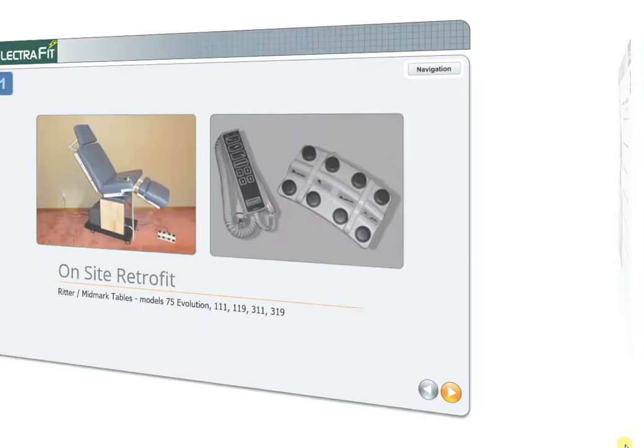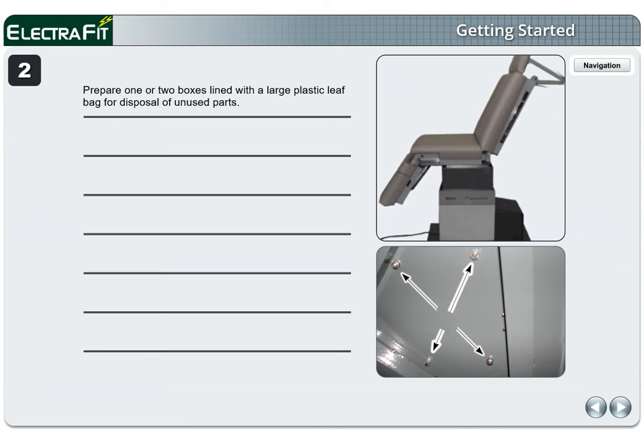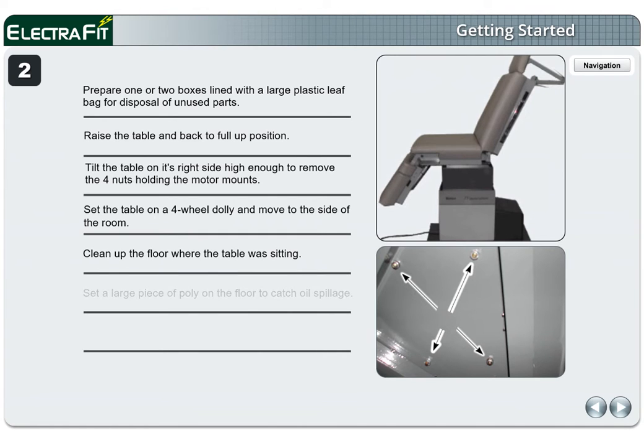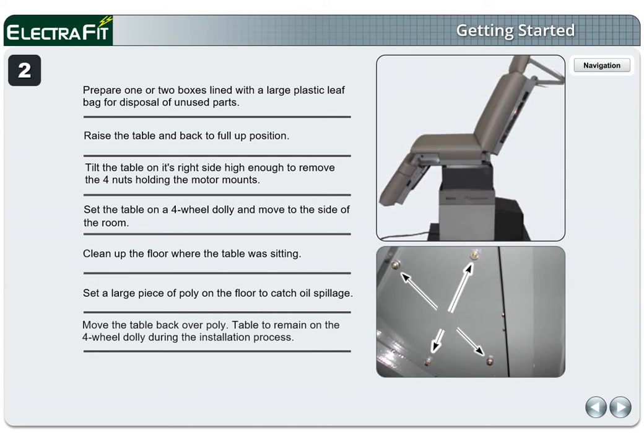Page 2. Prepare one or two boxes lined with a large plastic leaf bag for disposal of unused parts. Raise the table and back to full up position. Tilt the table on its right side high enough to remove the four nuts holding the motor mounts. Set the table on a four-wheel dolly and move to the side of the room. Clean up the floor where the table was sitting. Set a large piece of poly on the floor to catch oil spillage. Move the table back over poly. The table is to remain on the four-wheel dolly during the installation process.